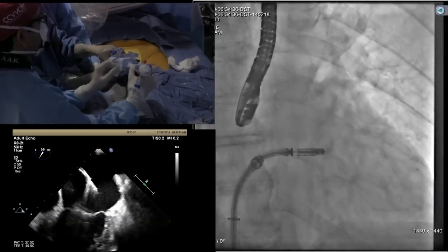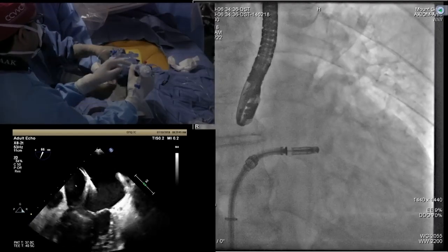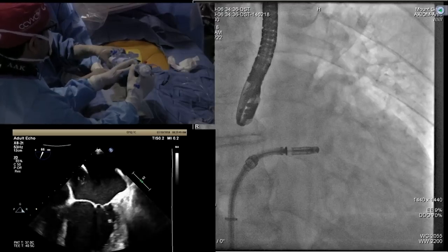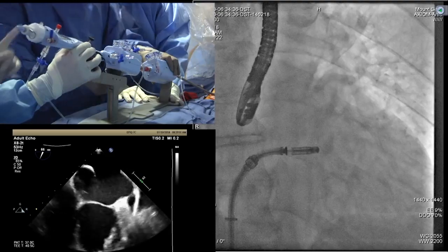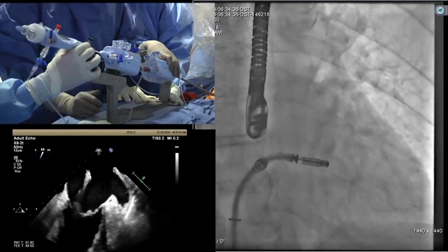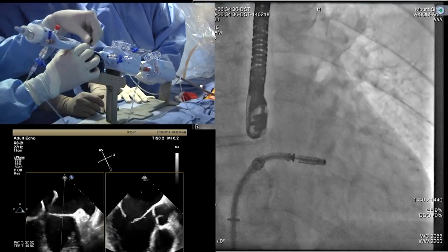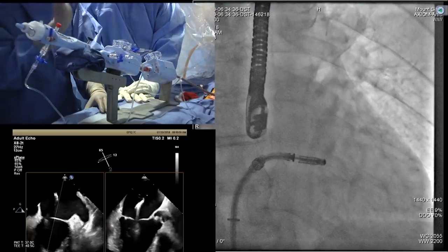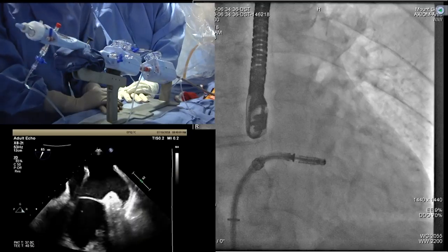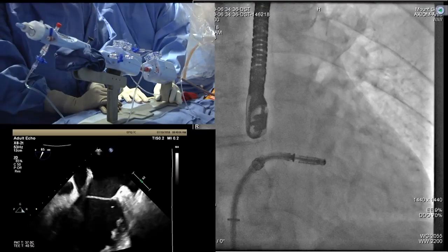Okay, so now I'm good at M. Do you want more? We have to constantly retract the DC handle. More M? Fluoro. At this point, why we were checking on fluoro is that the clip has to make a 90 degree angle on the fluoro. That's the time you know you have the appropriate amount of M.